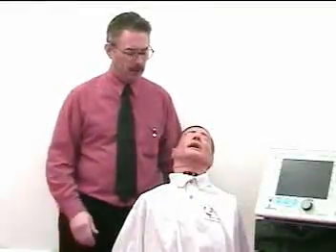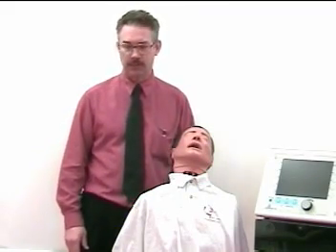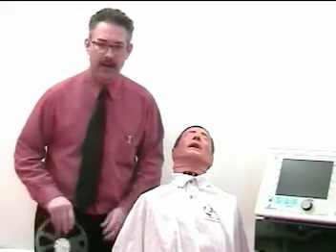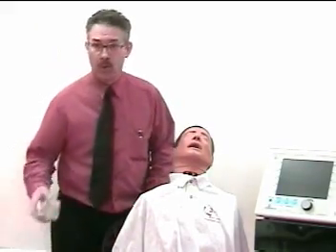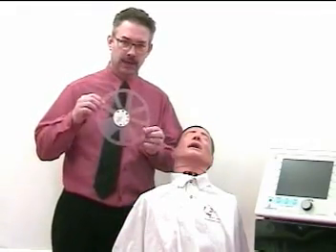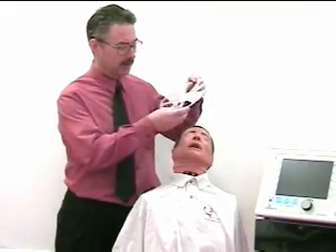Welcome. Today we're going to talk about applying a nasal CPAP to a patient. First off, you will want to correctly size the patient for the CPAP mask. For that, you should have some type of device that gives you the nasal mask sizing.